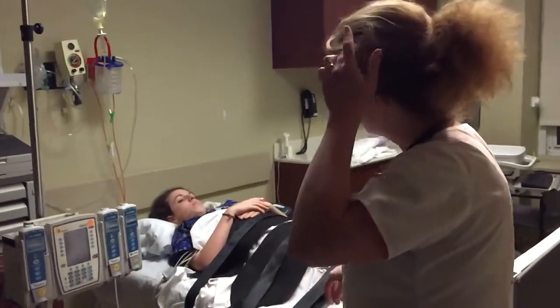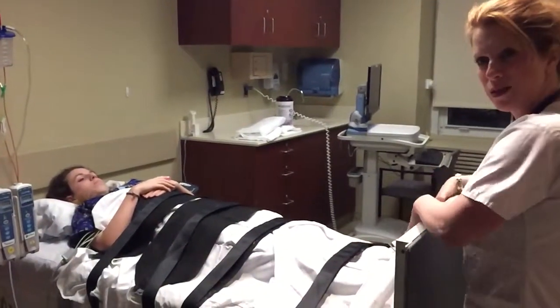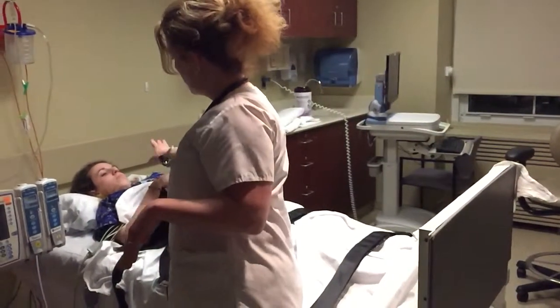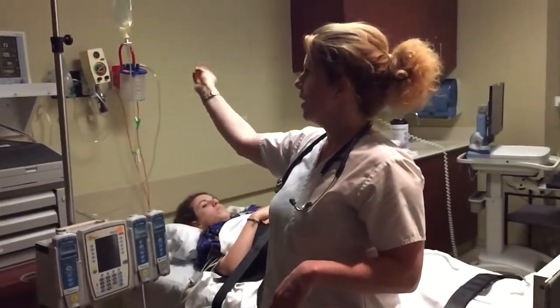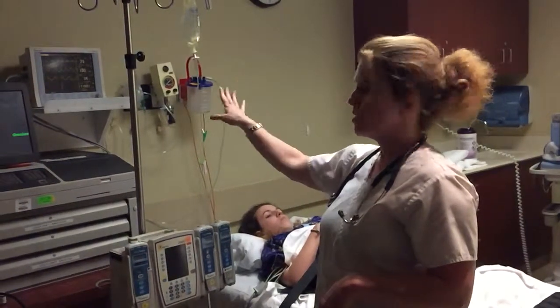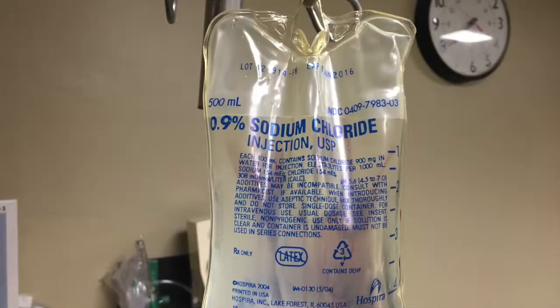We have the patient come in, and they have their clothes on from the waist down with their feet flat against the platform. They can keep their undergarments on top, but we give them a half gown or a Johnny coat so that we can attach them to our monitor. Again, we're going to be monitoring their heart rate and rhythm, their respirations, their blood pressure, and we're also going to be monitoring their oxygen saturation via pulse oximetry.